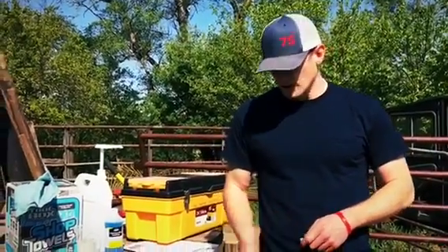Hi, my name is Nick Schwiedelm, owner and founder of 7S Cattle Company. Today I'm going to talk about the first step in a 7-day timed AI synchronization program, and that is CIDR insertion and GnRH shot.